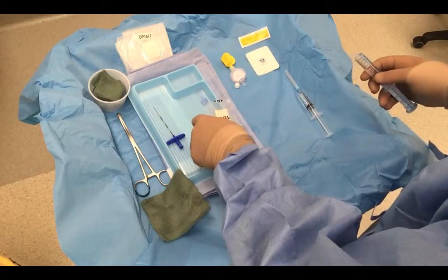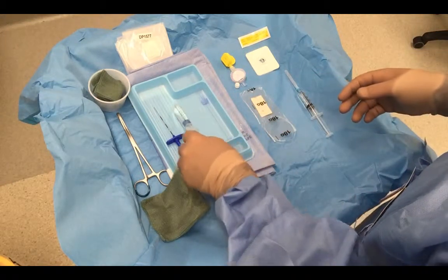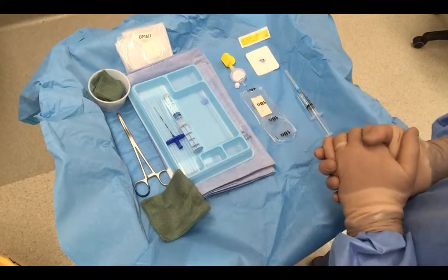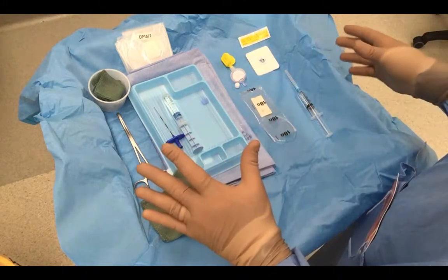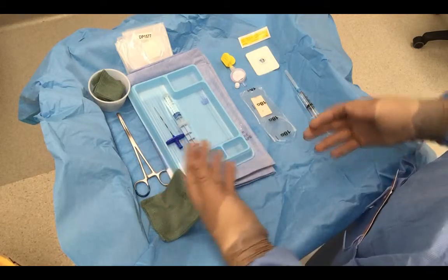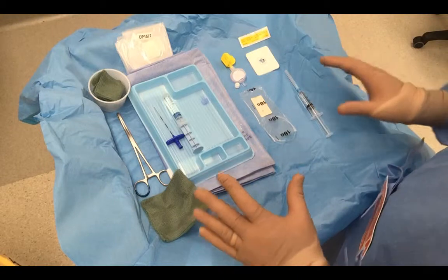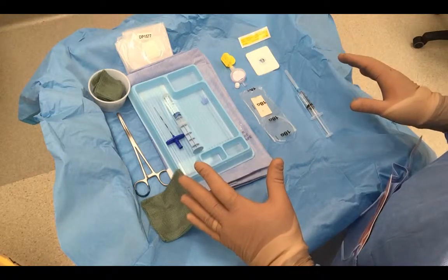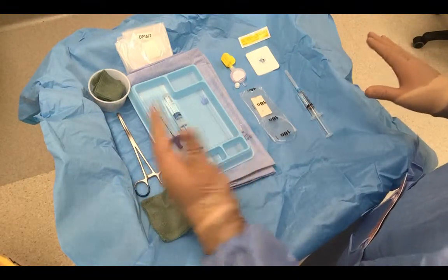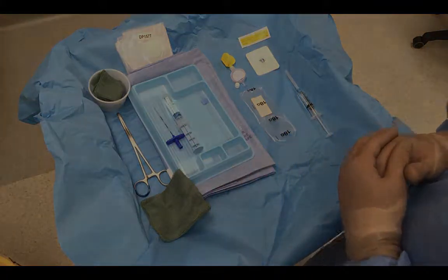So, hub is ready to attach. There's the catheter block for the end of the catheter. Got our loss of resistance syringe. Catheter's flushed. This is our tray. Most of the disposable trays have more equipment than this in case you're going to perform a CSE or some sort of other procedure or a more complicated procedure, or you have some other requirements. What I like to do with my epidural trays is minimise it so that I know where the next step is and only have the equipment that I actually require on board the tray.